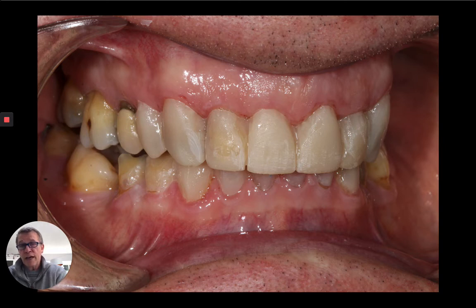So we can use that either in a more conformative way where we just conform to the function that they've got and make sure these teeth don't bash into each other again, or we can use it to monitor how successful we've been in changing the function. Maybe we're looking to give them a splint and change their chewing pattern a little bit, maybe get them towards a more vertical chewing pattern. And then once we've done that, we actually have proof that we've achieved that, and we can move forward. So there's lots of cool things that we can do.